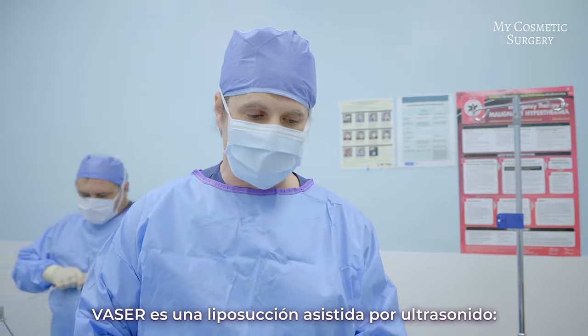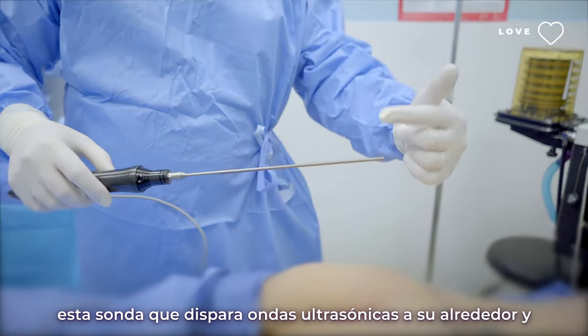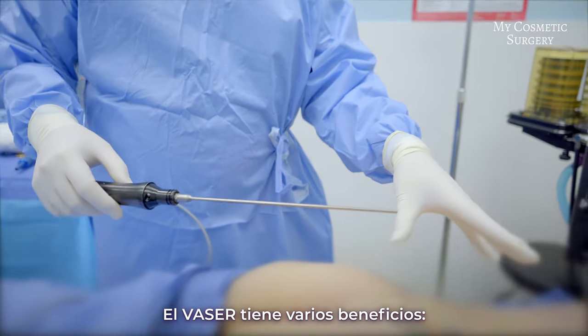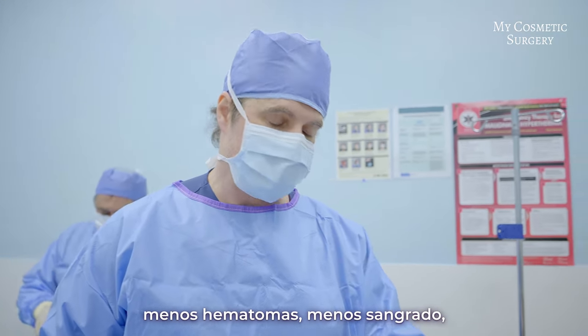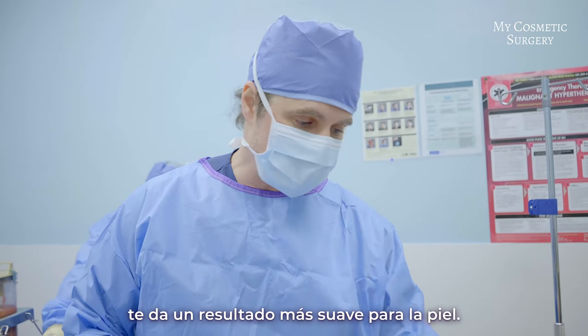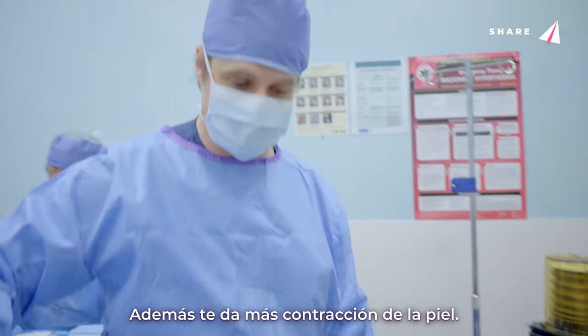We're using the VASER, which is an ultrasound-assisted liposuction. It uses a probe that shoots ultrasound energy around it to help break up the fat. Several benefits of the VASER are that by breaking up the fat it's easier to remove — less bruising, less bleeding, less traumatic injury to the patient. It also gives you a smoother result for the skin plus more contraction of the skin.